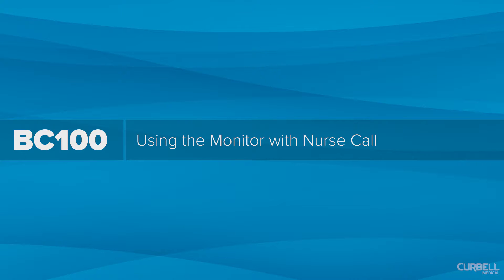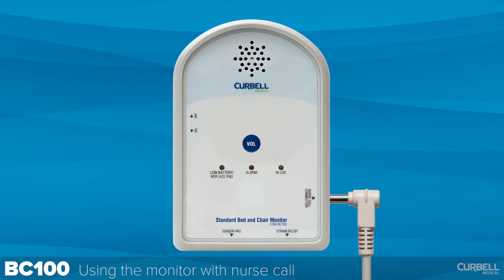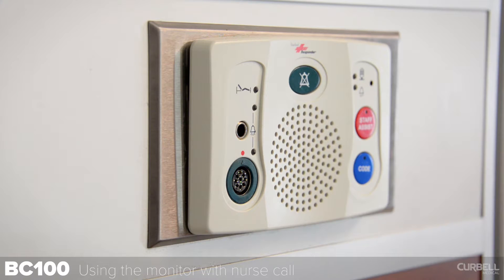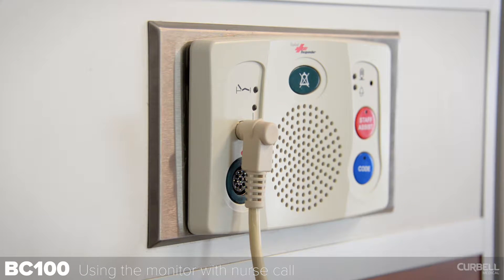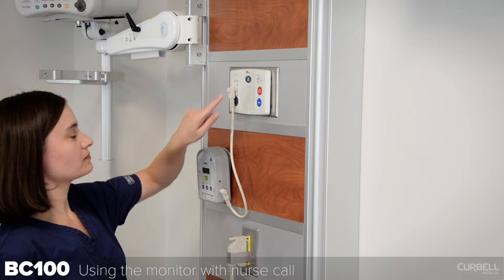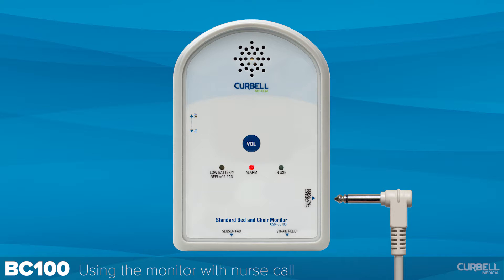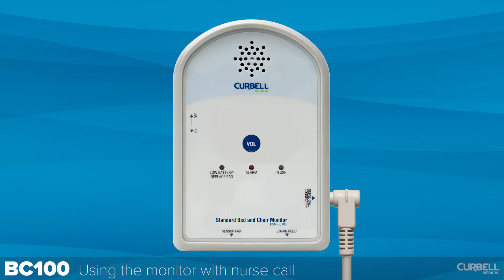Using the monitor with nurse call. To connect to nurse call, plug one end of the nurse call cable into the monitor's nurse call jack and the other end into the one-quarter inch jack on the patient station. If the monitor alarms, it will be necessary to reset the monitor by turning the on/off switch off then on again. You will also be required to reset the nurse call station. The monitor will alarm if the nurse call cord is removed, and may be canceled by turning the on/off switch off then on again, or reinserting the cord into the monitor.